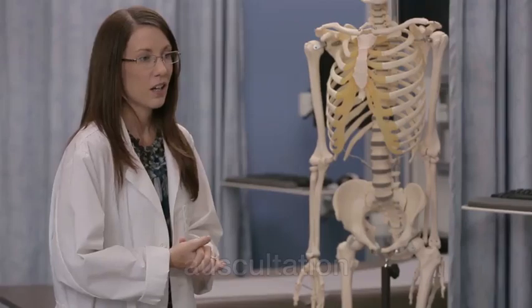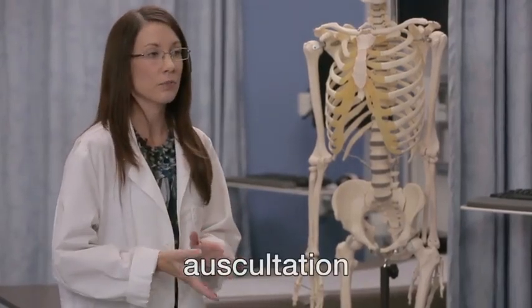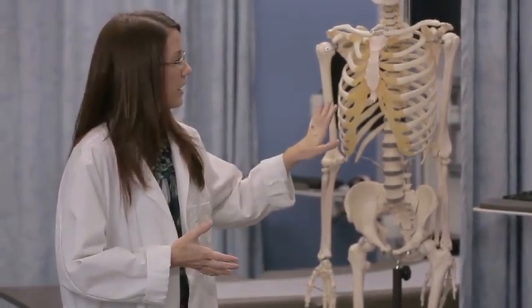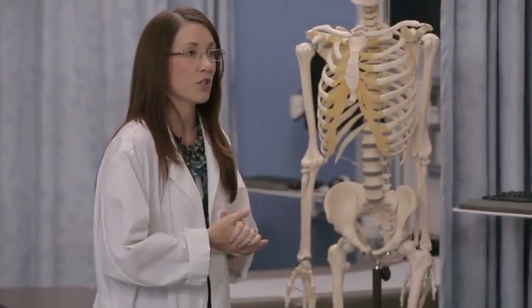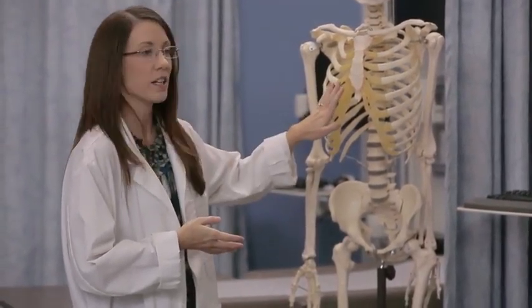Megan, can you clarify for everyone what auscultating or auscultation means? Auscultation is a clinical term we use to refer to listening to the internal sounds of the body, typically with a stethoscope. It's important to use those technical clinical terms, and what you hear with your own ear is very different from what you hear when you use a stethoscope.